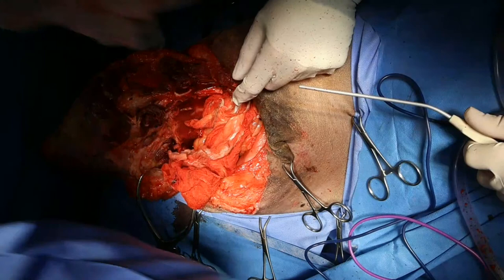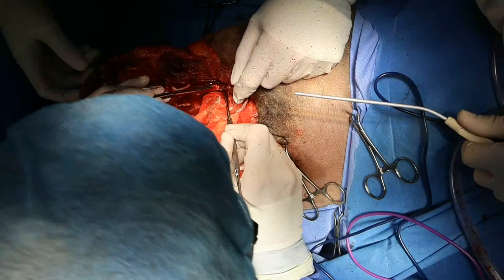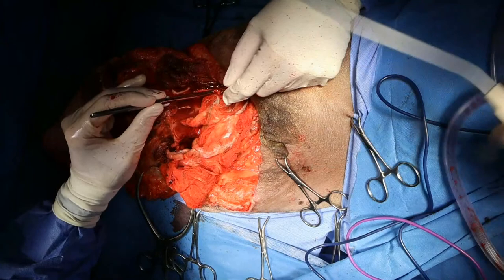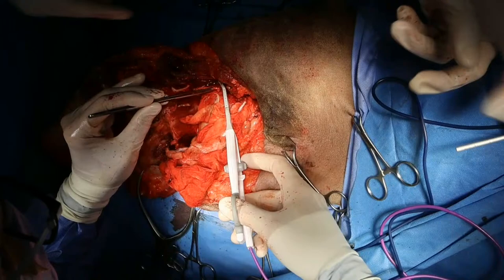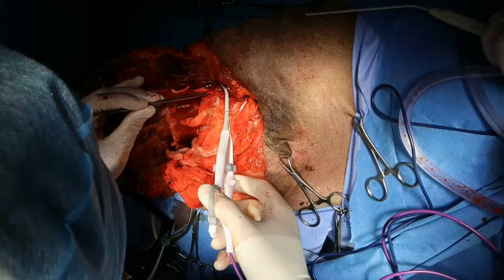One bone wax, are you fine? I think we're okay. Just making sure that there are no vessels. So there's more of the iliolumbar vessel. Just cut through the ilial wing. Okay.